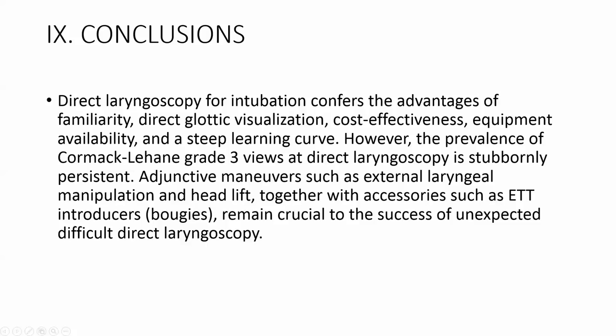Now I've copied the conclusions from the chapter, and I think it's worth reading these carefully and thinking about the purpose of video laryngoscopy. It starts off contrasting direct laryngoscopy, which is what we normally do, with the new technology.